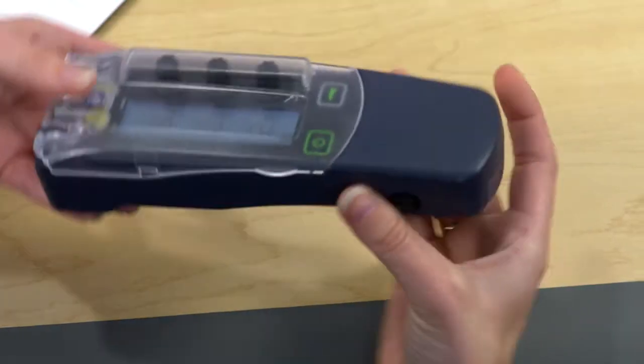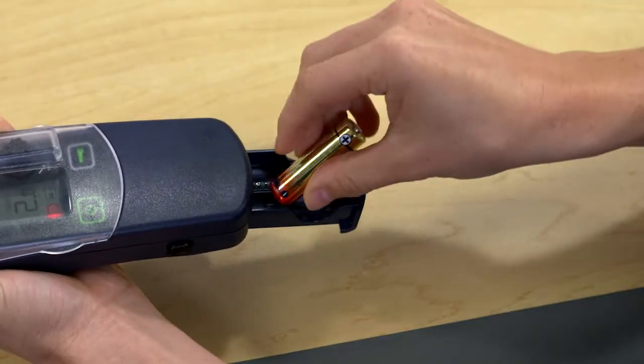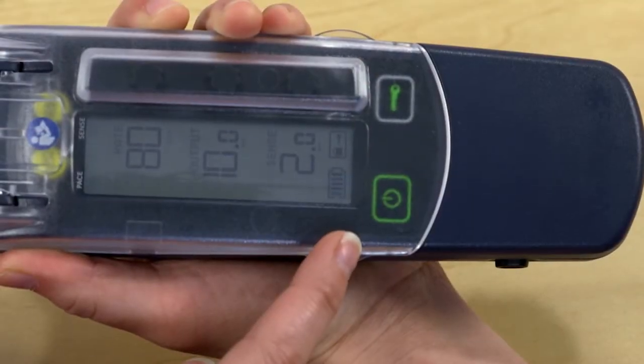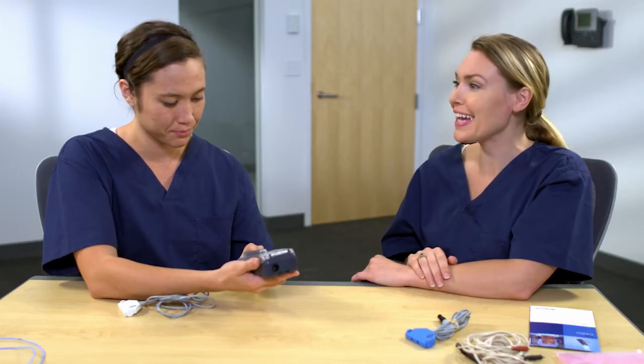Yes. Press the side buttons simultaneously to release the battery drawer. The battery drawer shows the direction for battery polarity. Once the new batteries are placed, the battery indicator will show all bars. Great job, Kristi.